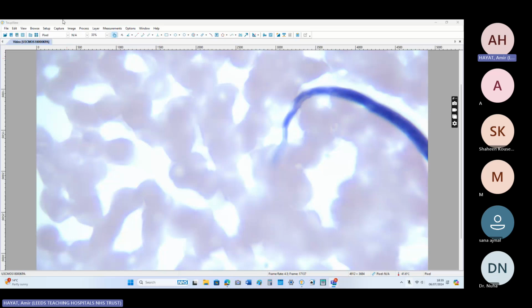Then there was Brugia malayi, B for Brugia and B for binuclei. They have two nuclei at the tip of the tail. And another one was Vemti, for Wuchereria bancrofti. Bancrofti is empty, or Vemti. Their tail does not contain any nuclei. The tail portion is empty of nuclei, while Loa loa extends to the lower end of the tail.